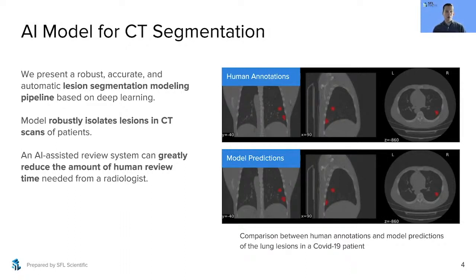However, it is also possible to extract the volume of the found lesions using this model. It should also be noted that with the fast data access speed allowed by the NetApp ONTAP system and running on the NVIDIA DGX, the model takes an average of only 6 seconds to make predictions on each scan, allowing for fast and accurate output that can be integrated into modern healthcare information systems.